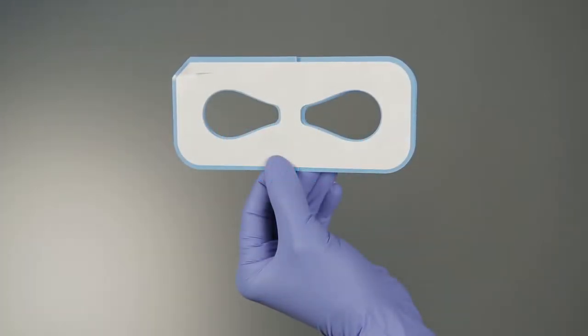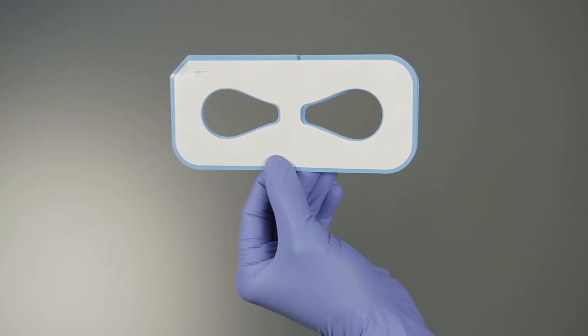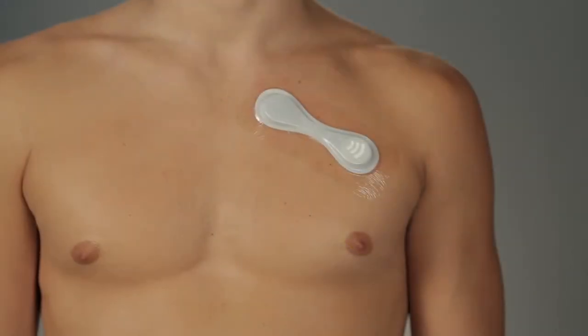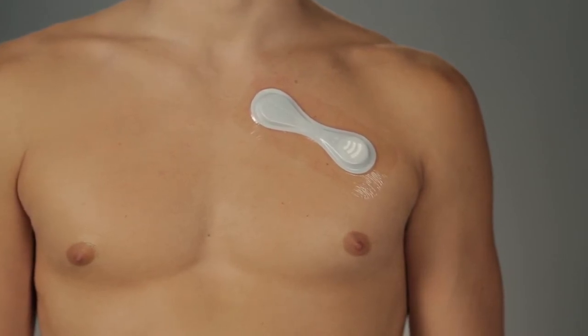Some patients may need to apply an additional Tegaderm adhesive overlay to maintain proper biosensor adhesion for the duration of the monitoring period. The adhesive overlay is placed directly over the vital patch biosensor, then worn in conjunction with the biosensor. Both are removed and discarded at the end of the monitoring period.